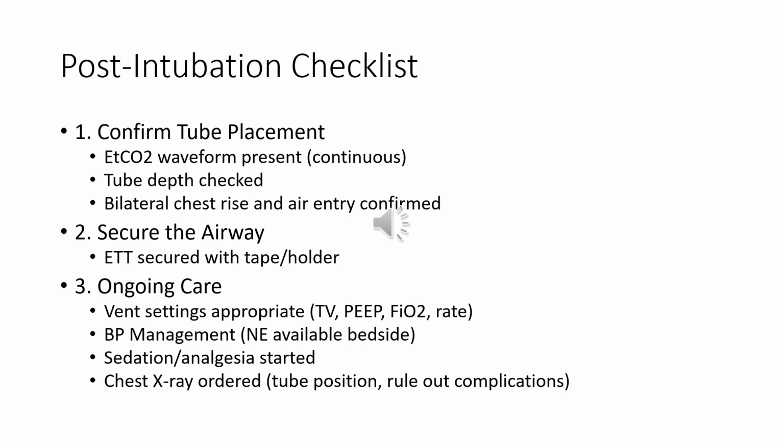Ongoing care measures should be arranged for. Appropriate vent settings should be set. Hemodynamic stability should be monitored. Sedation and analgesia should be started.